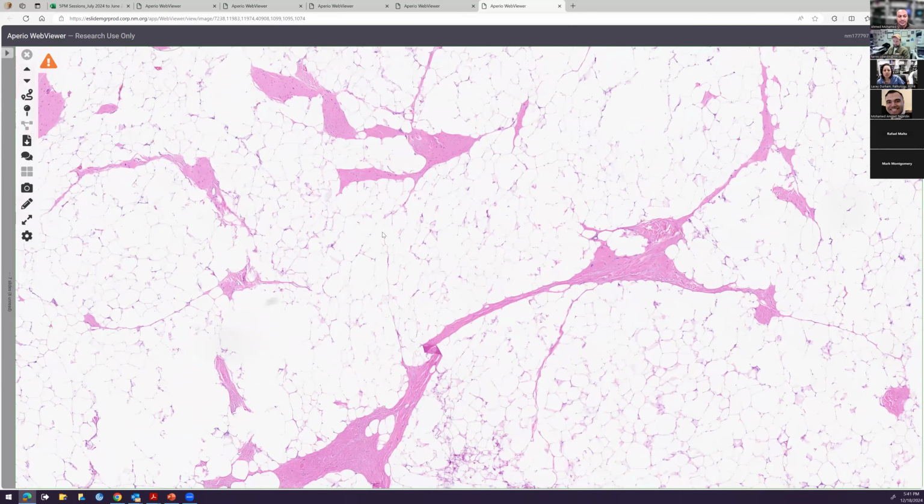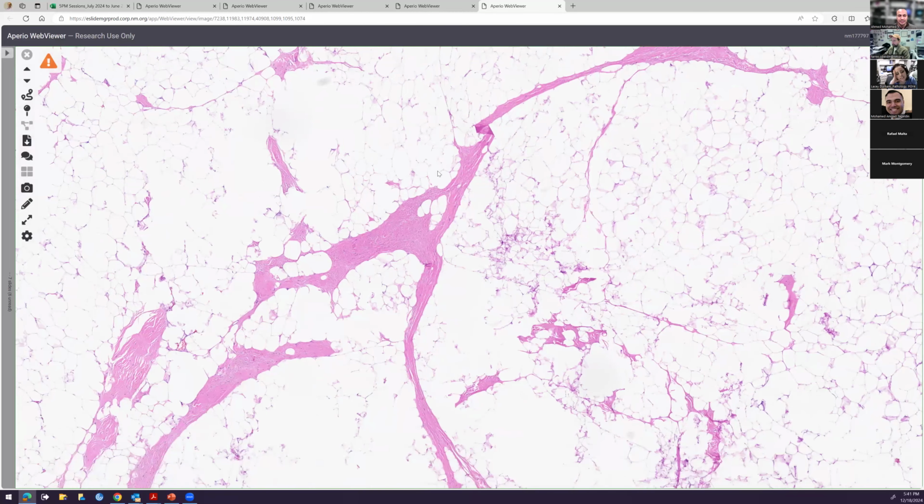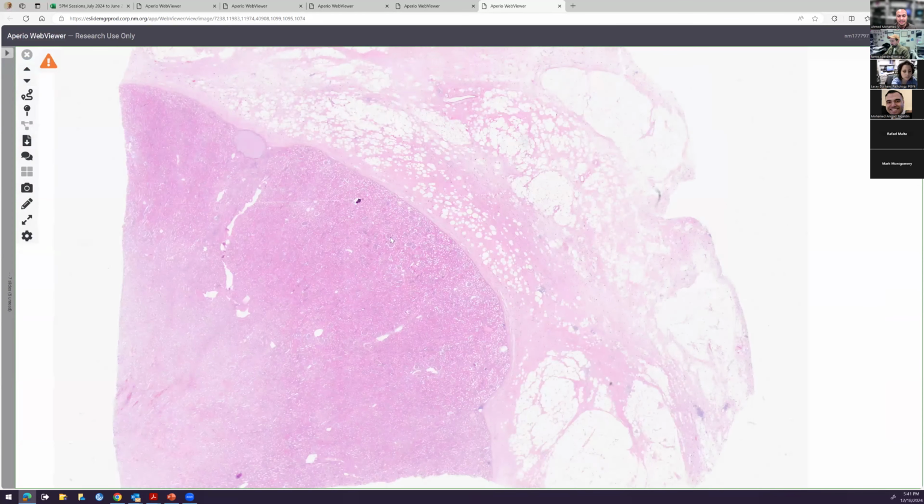The tumor is the exact same. It is the same tumor. It's just we're trying to be nice about it in some areas and we're trying to be mean about it in other areas. But generally, when you're in a bad location like the retroperitoneum or the thoracic cavity, you'll call it well-differentiated liposarcoma. Okay. So that's a good example of one. Let me see. Do I have another one? I do have another one. All right. Where are we?